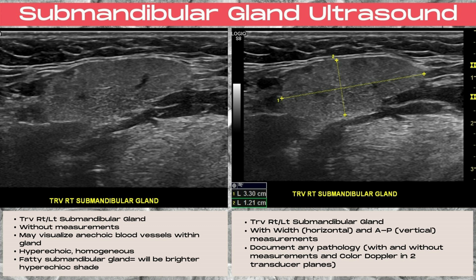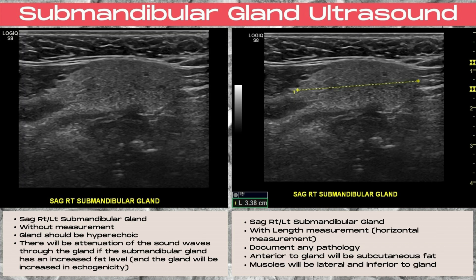You can commonly visualize small anechoic blood vessels within the center of the glands. You want to also document any pathology with and without measurements and color Doppler in two transducer planes. The sagittal right and left submandibular gland should be documented with and without a length measurement, which is a horizontal measurement on the ultrasound. You want to document any pathology. Anterior to the gland will be the subcutaneous fat, and striated muscles will be located laterally and inferior to the gland.